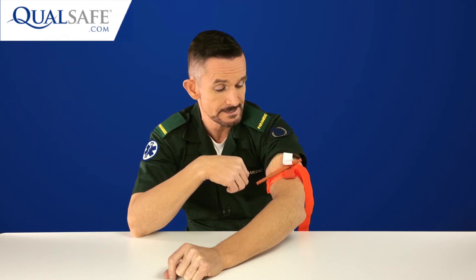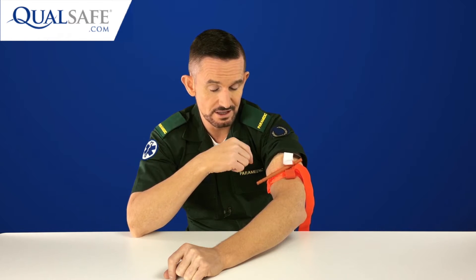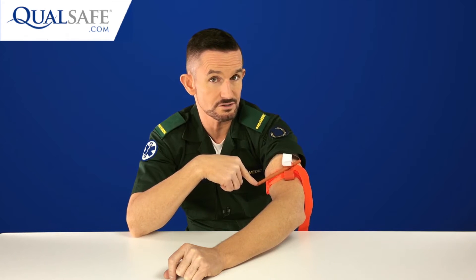I've just tightened this a couple of twists, but I'm not going to go any tighter because it's on my arm and it hurts. In real life, I would need to tighten this much, much tighter — probably another good two turns — in order to occlude arterial blood flow and stop the life-threatening bleeding. What we need to be teaching is to tighten it enough to stop the pulsating, life-threatening bleeding.